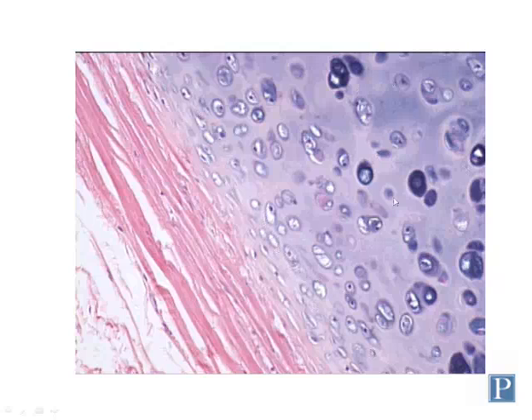The more mature cartilage out here contains chondrocytes. So chondroblasts initially lay down the cartilage, and then the cartilage is maintained by chondrocytes. Chondroblasts differentiate into chondrocytes. The chondrogenic zone contains a larger number of these chondroblasts in a smaller area. So you can see the cells are smaller and packed more closely together than those in the more mature matrix.